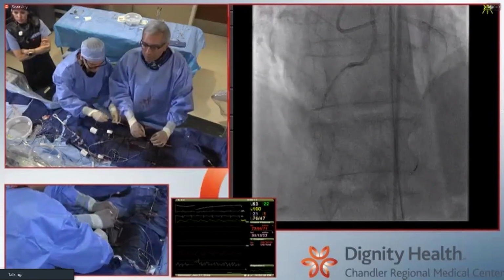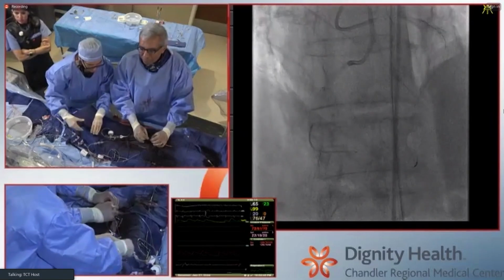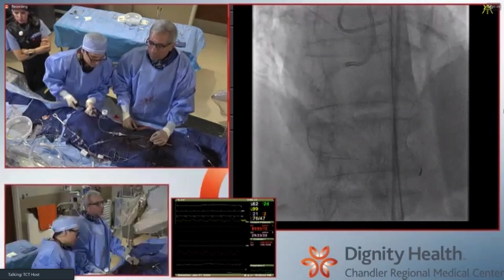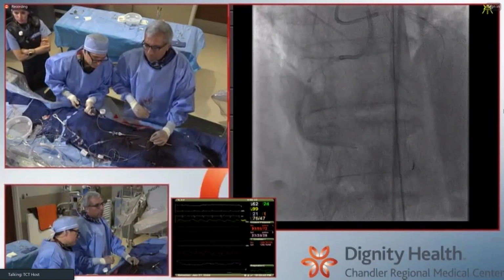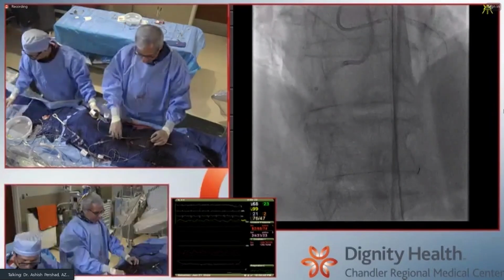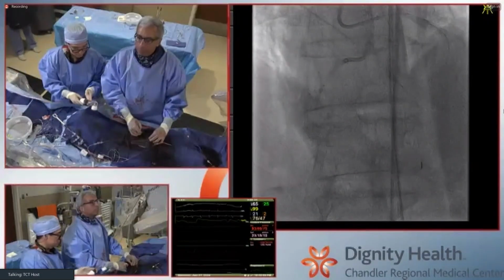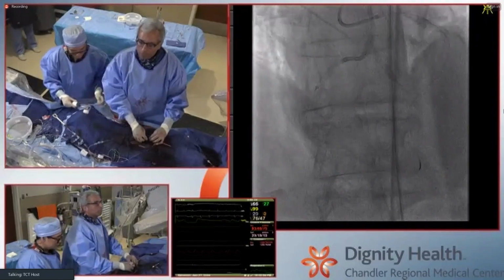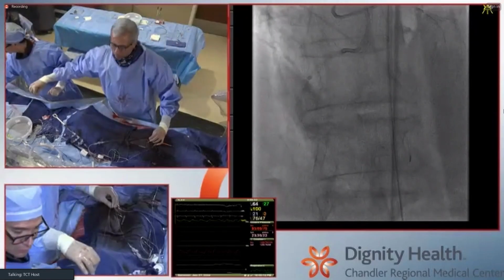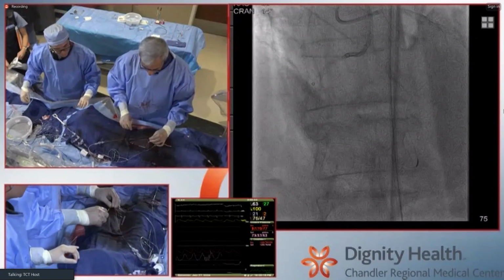If we look into the serial OCT baseline follow-up, and if we look into only the in-stent restenosis cases, we see 30% of the cases is actually chronic stent recoil. And the important predictor of the chronic stent recoil is calcification. With asymmetric stent expansion, you are stretching only one side, so you are more likely causing the chronic stent recoil. That's what we are going to publish. So I think in this case, I recommend not a super thin strut, a regular stent strut.